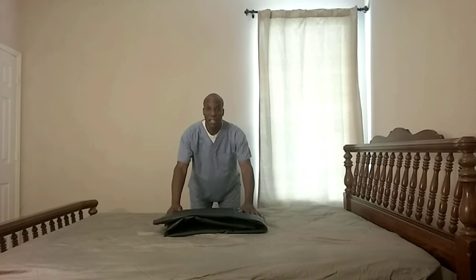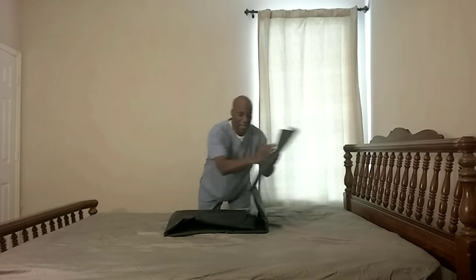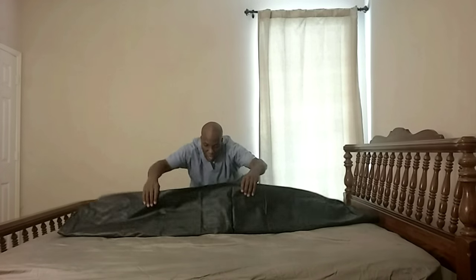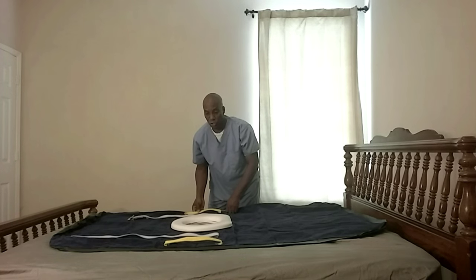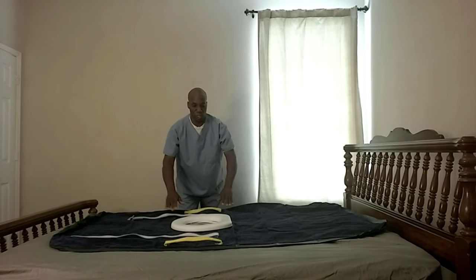Introducing the solution: the air bedpan system. It starts as a simple air mat that comes in a box. We unfold it, and it reveals the toilet seat and our other safety devices. It's a soft toilet seat with a chamber in the middle, hand straps for the user to hold onto for safety, and also a safety belt.